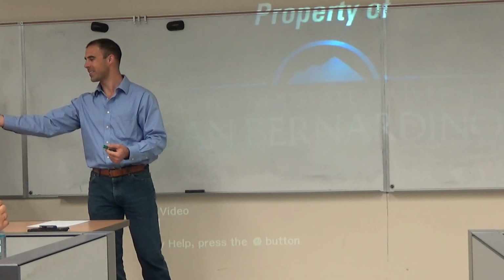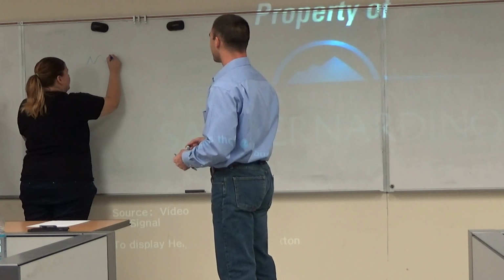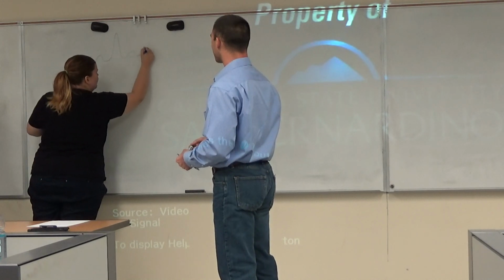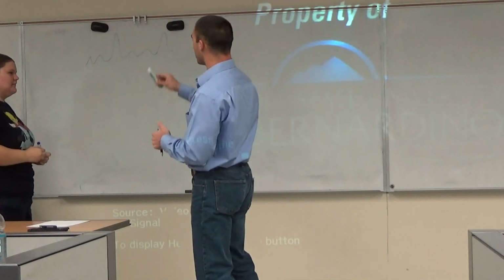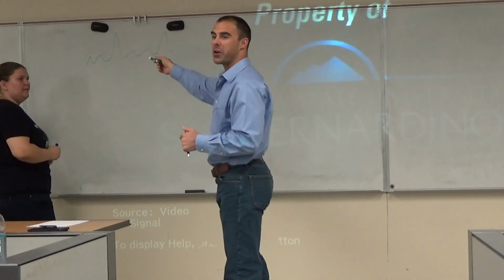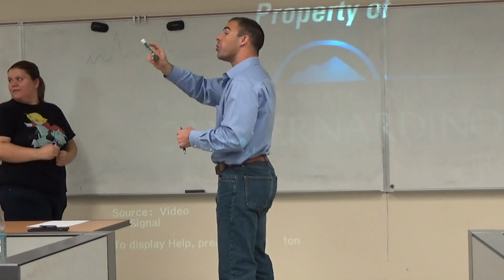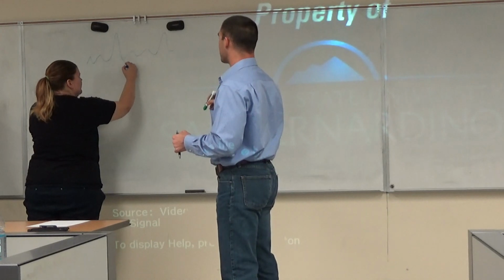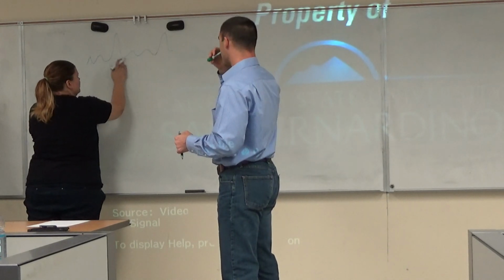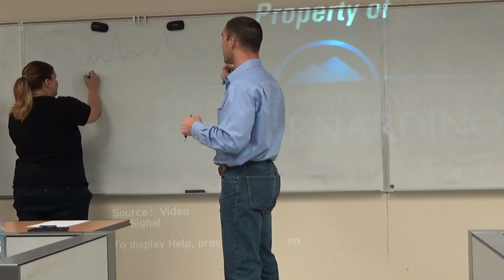So kind of have regular data here, and then a blink is like this, and it's back down. But you've got to add one little element to that, right? How do we know that that's not brain activity going up really high? There is a lower one that goes along with it, yes. Right? Well, it's not going to be on the same trace. It would have to be on a different trace, right? Because you have an upper eye electrode and a bottom eye electrode.